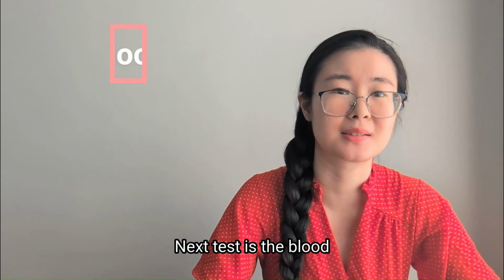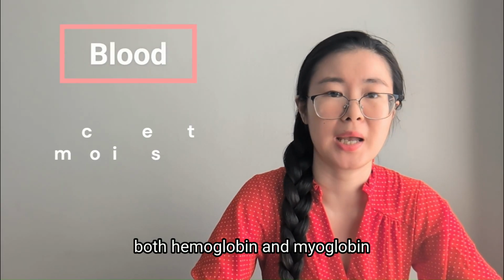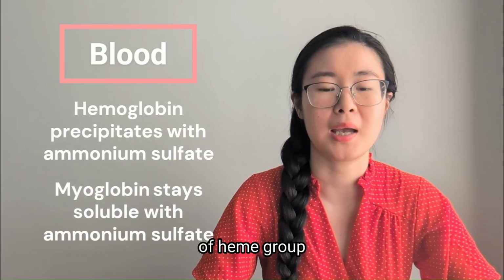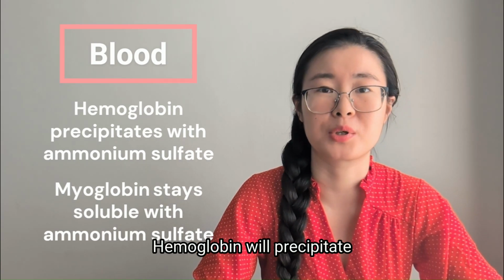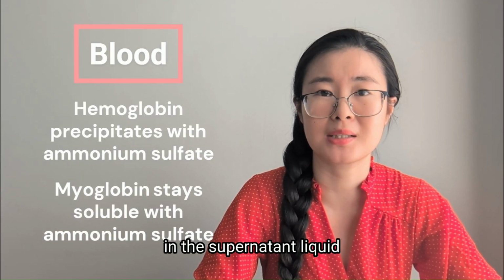Next test is the blood. It turns positive with both hemoglobin and myoglobin because the reaction is based on the existence of the heme group. And how to differentiate that? You run an ammonium sulfate test. Hemoglobin will precipitate and myoglobin will remain in the supernatant liquid.